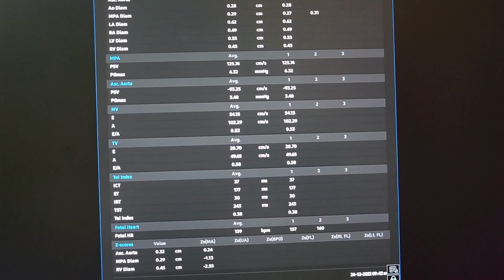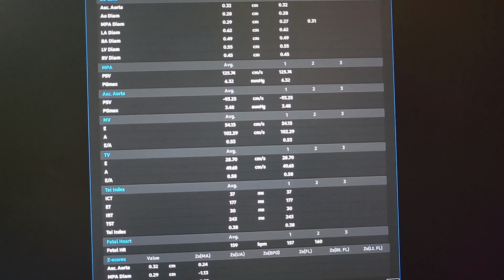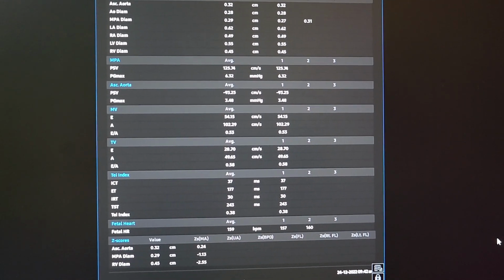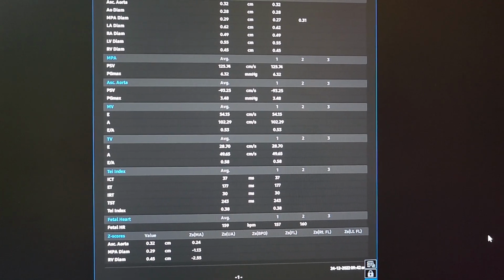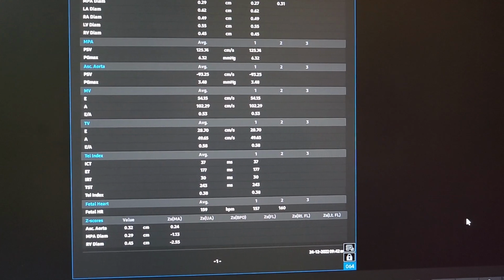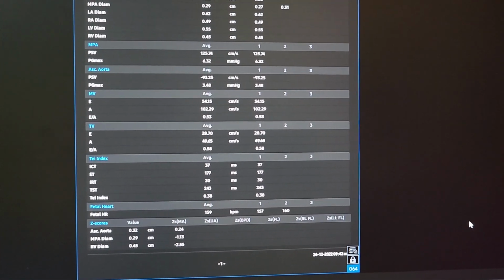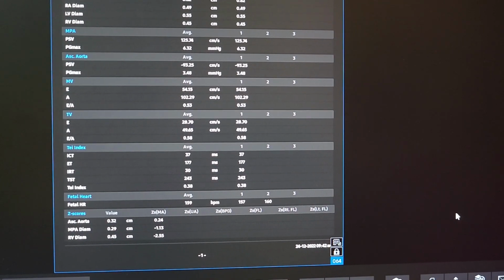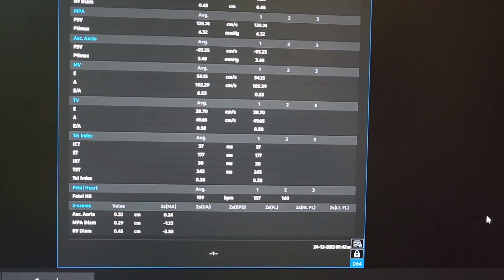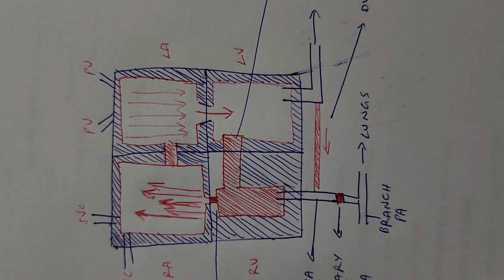So this is about this fetal echo at 18 weeks of gestational age. Rest of the anatomy was perfectly normal. We have suggested pediatric cardiac consultation and also advised amniocentesis and chromosomal microarray. Now, once you have done this, we will look at how to counsel the patient and how to make them understand. And I will show you the counseling sheet and drawing in a short while.